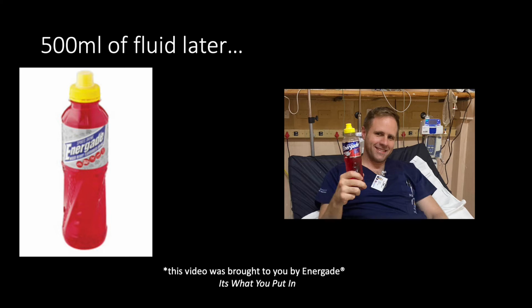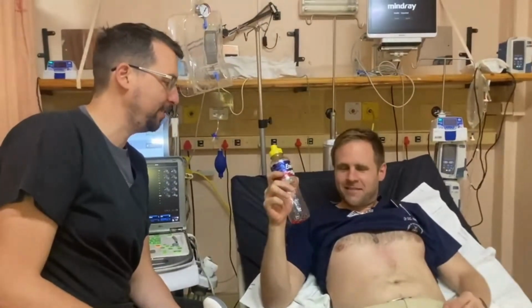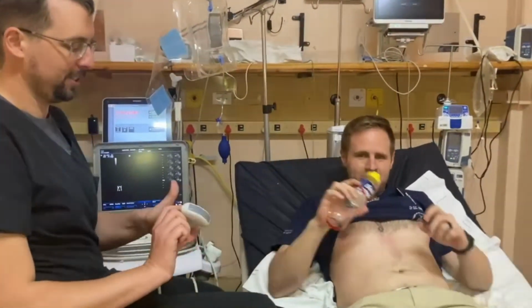Okay, so now that we understand what a normal empty stomach looks like, let's proceed to show you how it changes with some clear fluids. Alright guys, so Don just had a whole bottle of Energade. Let's see if there's any difference on the sonar.